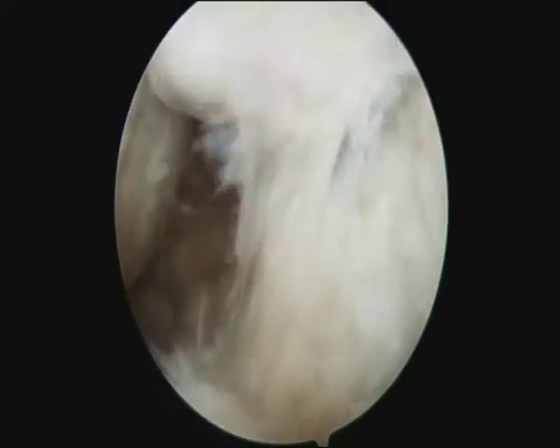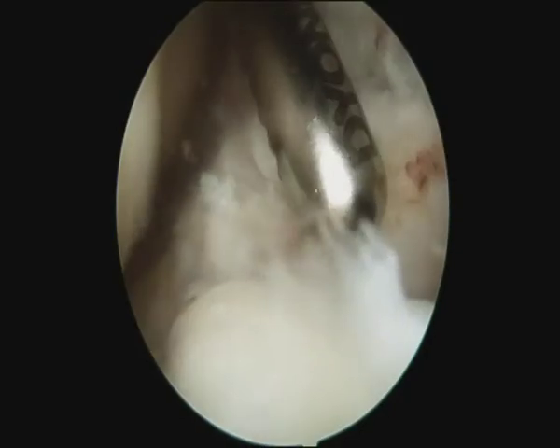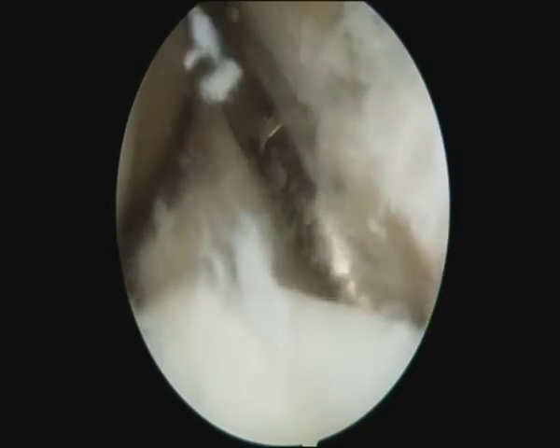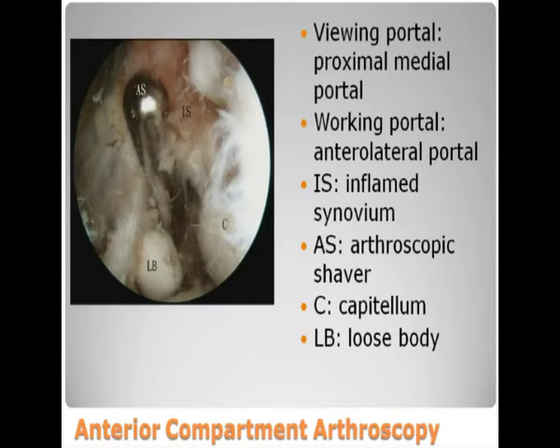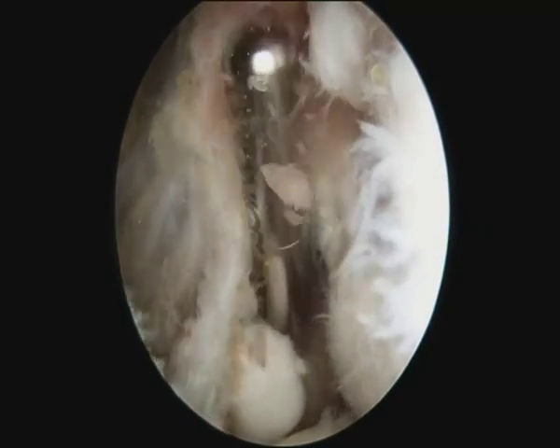Large loose bodies can be cut into small pieces to facilitate their removal. After that, the arthroscopy is switched to the proximal medial portal, and the lateral part of the anterior portal can be divided so the loose body can be removed with the anterior lateral portal as the working portal.